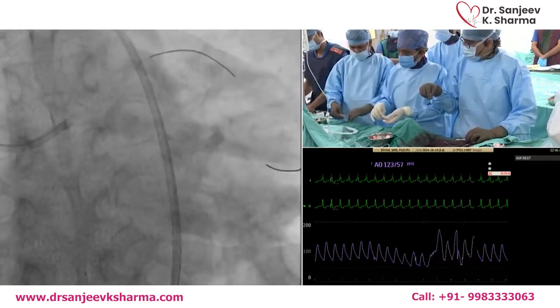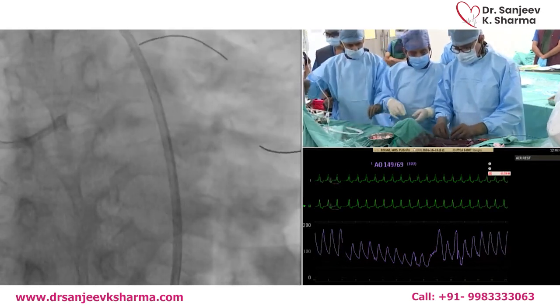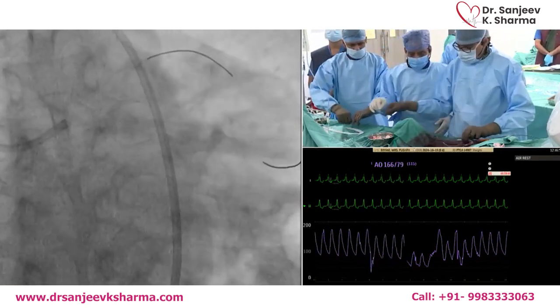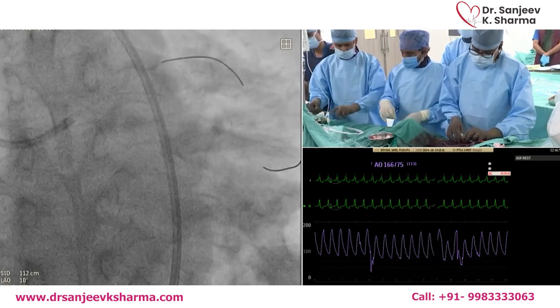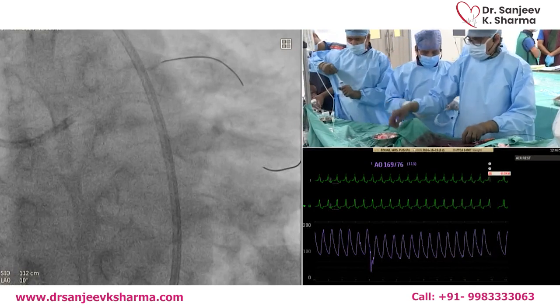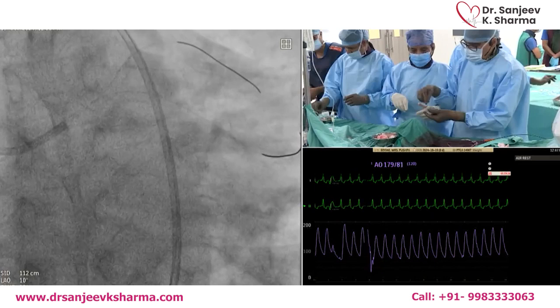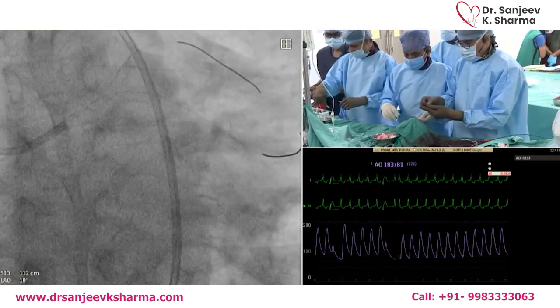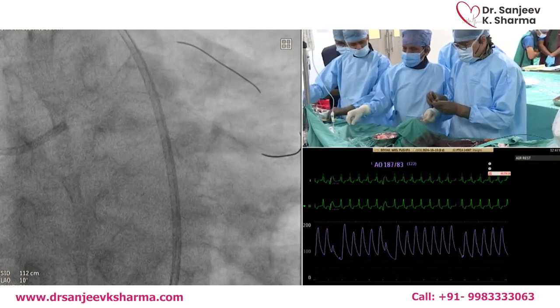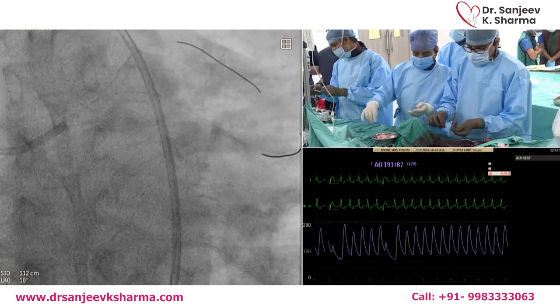And we have a 3.5 in the same region that we are still going with. Now the question is, where do you use the IVL? I would say that if IVL is the price of the cutting balloon, then in every case in my opinion where you are using a cutting balloon you can use IVL. The biggest advantage of the IVL is that it cuts the calcium without causing perforation. But there is a big difference in the cost. I know that by next year we'll have at least 3 other IVL devices. One of them is actually laser energy, and they are starting the trial.